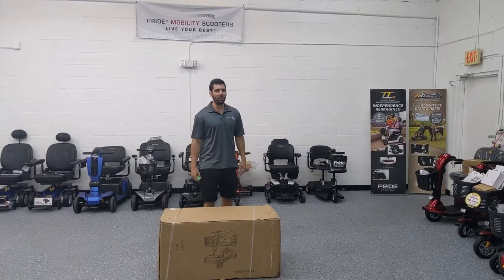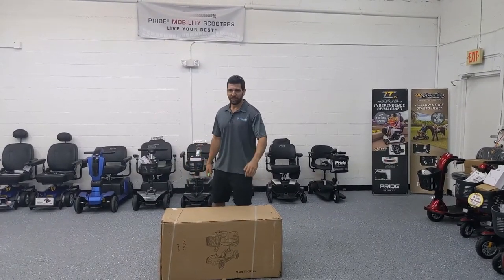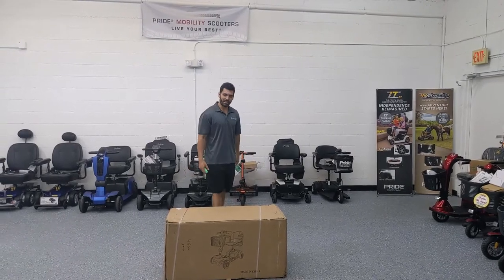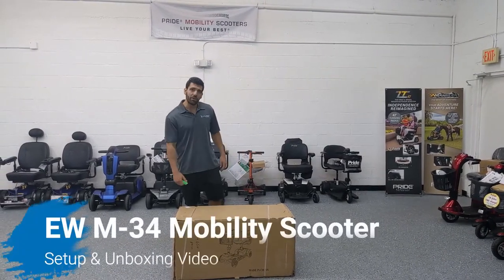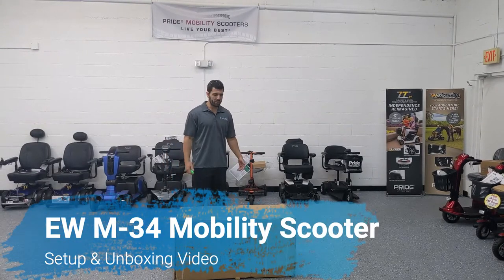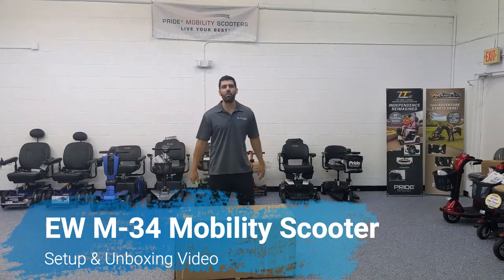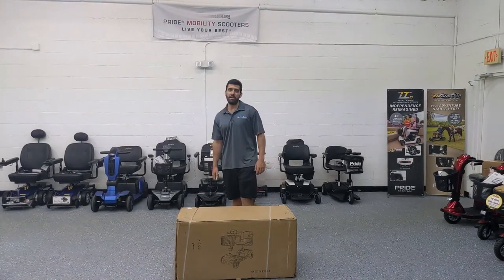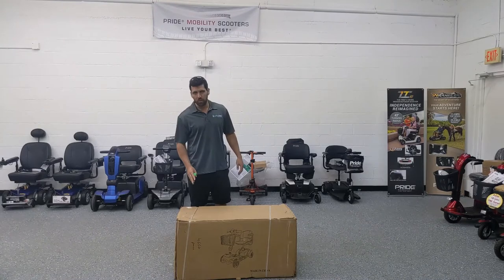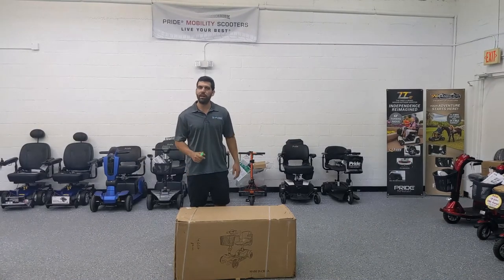Hi everyone, I'm Sergio with Mobility Scooters Direct. Here today to do another unboxing video. Today I'm going to show you how to set up and how to use the EW M34. It's a mobility scooter by E Wheels, capable of holding up to 300 pounds, going 4 miles per hour, and up to 10 miles on a full charge. When fully disassembled, the heaviest piece weighs only 29 pounds.